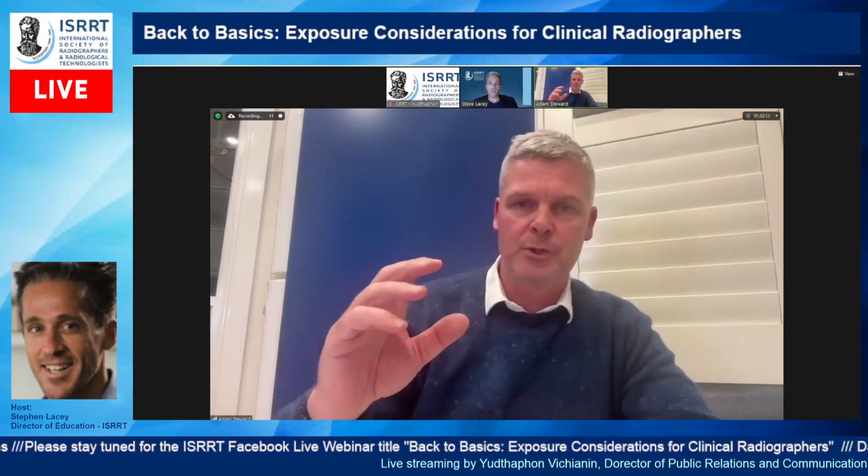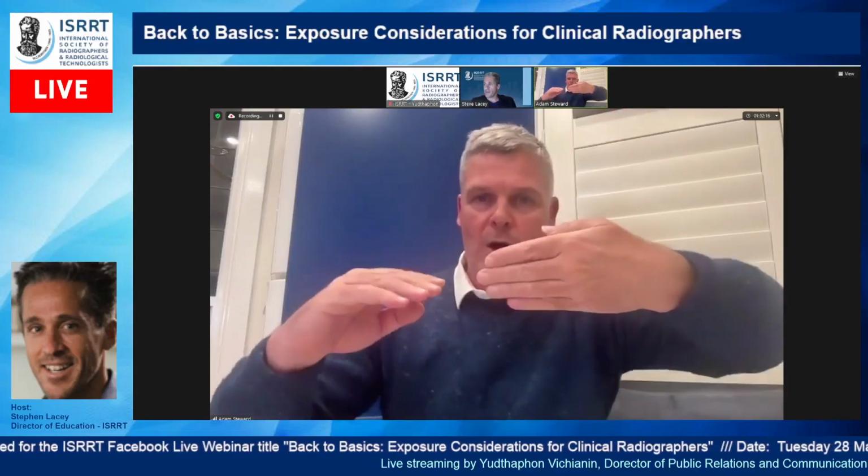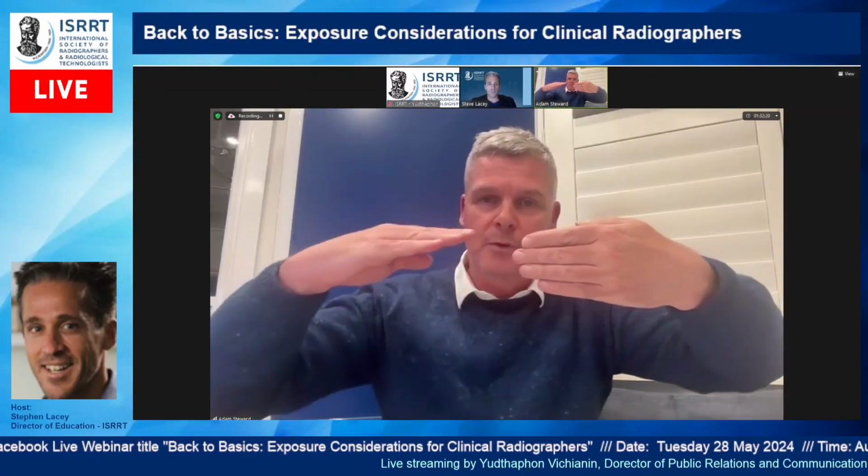The way I would use a compensatory filter, and a compensatory filter is basically where you've got a discrepancy in tissue thickness. You might have one part this thick and one part this thick. You've got two areas, and you're going to use a compensatory filter here to try and even that density out. So in that case, the filter will take care of evening the density out. All you would need to worry about is setting the exposure of the part that doesn't have the filter on it.